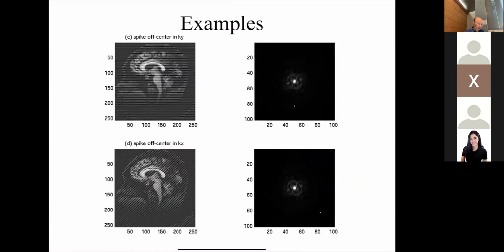Another interesting thing that you see sometimes in MRI, although you don't want to see these, are what are called corduroy patterns or zebra patterns in your image. These occur when something has gone wrong, okay? And so basically, imagine this is the Fourier transform of my object, and let's say at some point in time, someone just injected some energy here, okay? This could come from, for example, maybe someone opened the door at that point and some RF energy got into the room, or it could even happen when someone didn't screw something down and something's vibrating, and just metal hitting each other can induce enough energy that the MR signal picks it up, okay? So we occasionally see this, but we try to make sure we don't see it.